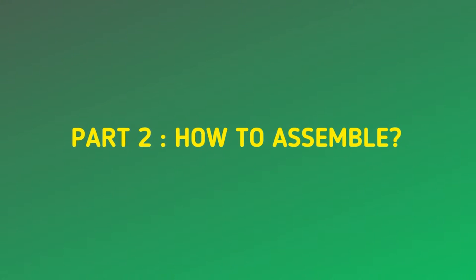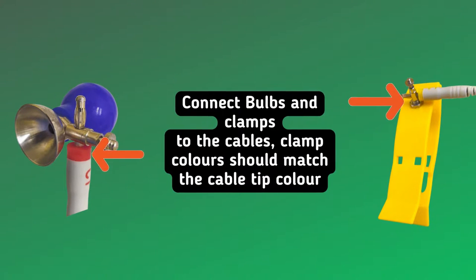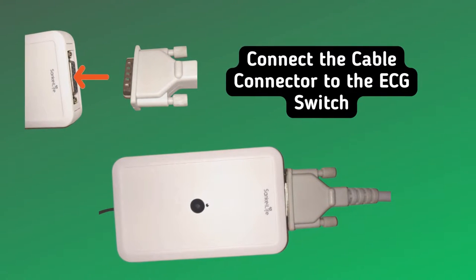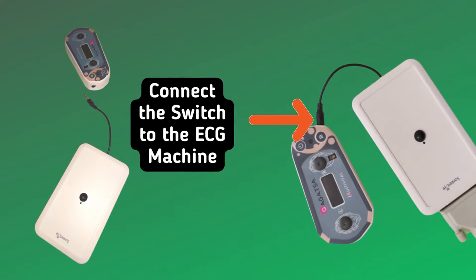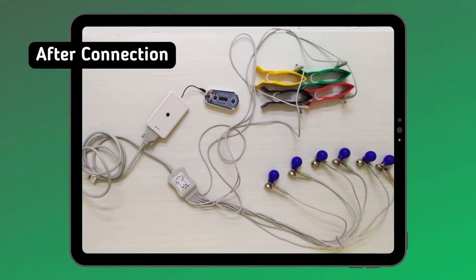Part 2, how to assemble. Connect bulbs and clamps to the cables. Clamp colors should match the cable tip color. Connect the cable connector to the ECG switch. Connect the switch to the ECG machine. Finally, it will look like this.